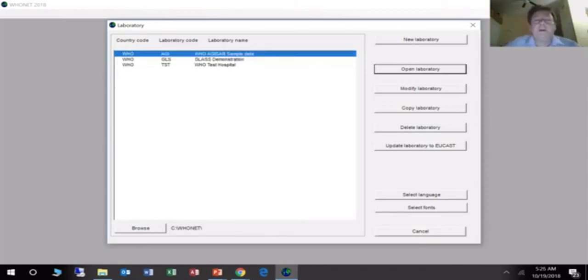And the first one, AGISAR, is the WHO's Advisory Group on Integrated Surveillance of Antimicrobial Resistance. This particular example includes 300 human, animal, and food isolates. So when I'm working with food and animal and Salmonella public health labs, I use the AGISAR data set as a more interesting, more relevant example for them.